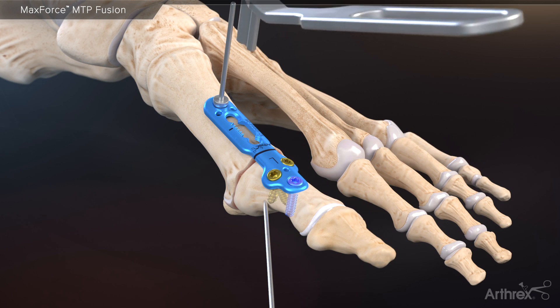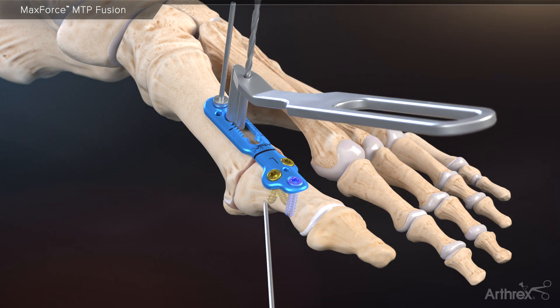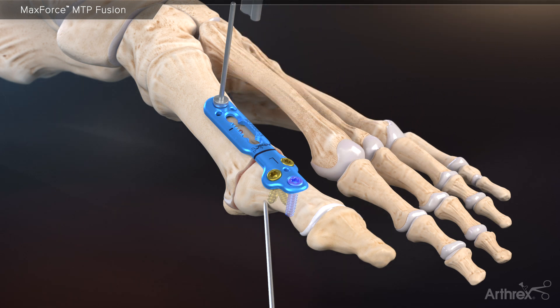Next, use the MaxForce compression drill guide to create a bicortical bone tunnel with a 2.0 millimeter drill. This creates the pilot hole for the geared MaxForce compression tool. With the BB tacks still in place, insert the MaxForce compression tool through the bone tunnel until the gears mate with the MaxForce plate. The black line on the plate should align with the black line on the compression tool.